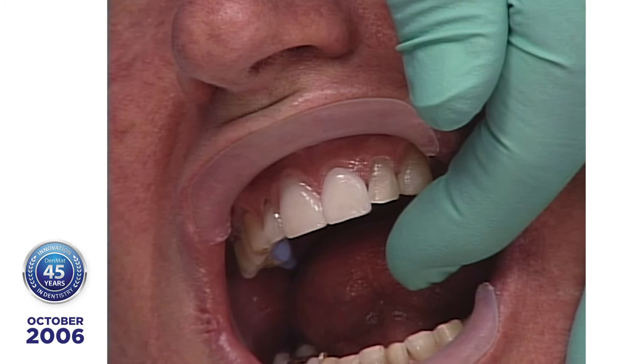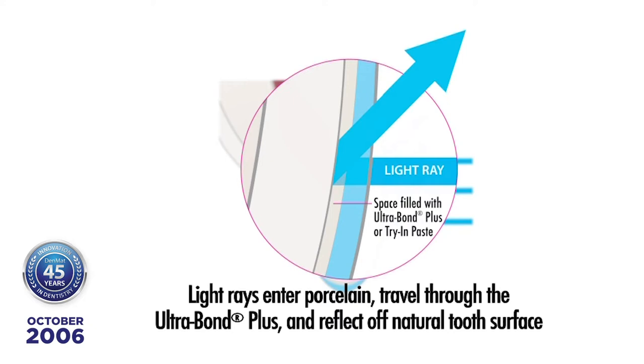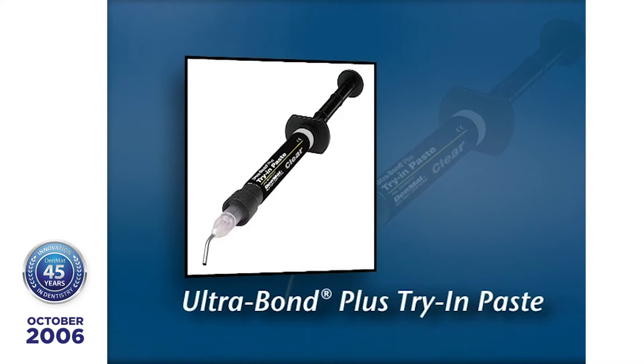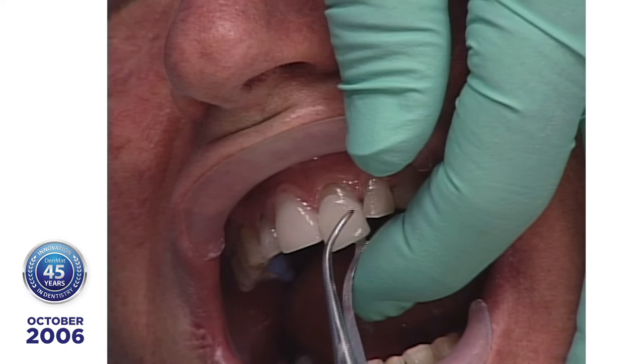Now, when we put the Ultrabond Try-In paste in, it goes all the way through to the tooth and it gives you a more natural appearance. So that's why using the Ultrabond Try-In paste is critical. The Ultrabond Try-In paste is exactly the same as Ultrabond without the activators in it. Now we're going to let our patient do the final selection of the shade.